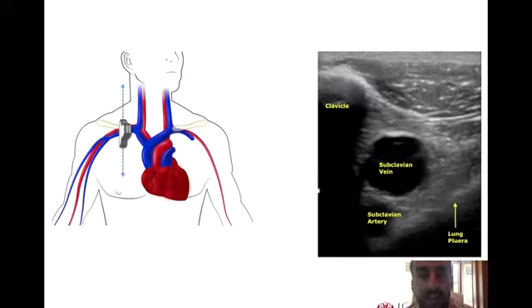Here's an ultrasound image of just that, placing the ultrasound probe here transversely over the clavicle so that the top footprint of the ultrasound probe is on top of the clavicle. We visualize the connective tissue here, the subclavian vein diving below this. Again, this is at the proximal medial half from the clavicular line. We see our vein, we see the artery, and then you can see the lung pleura not that far away.